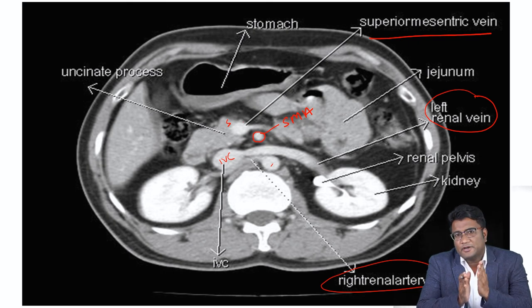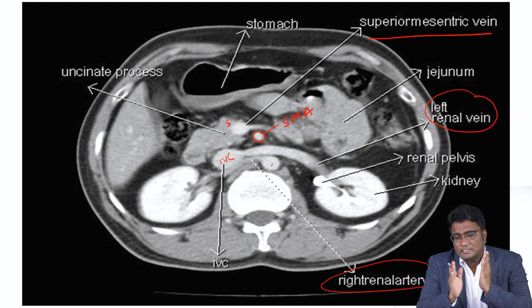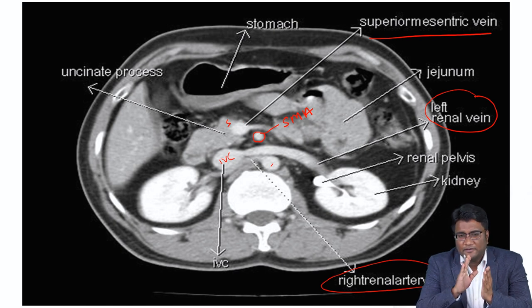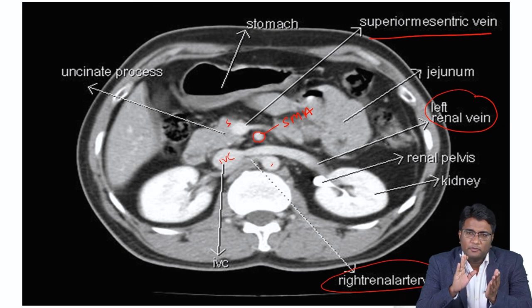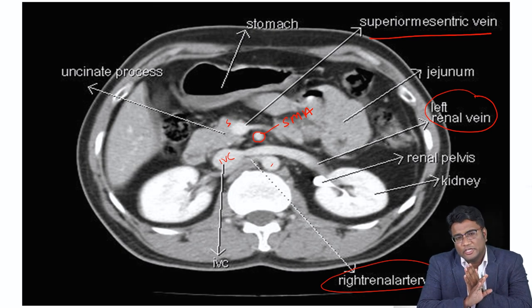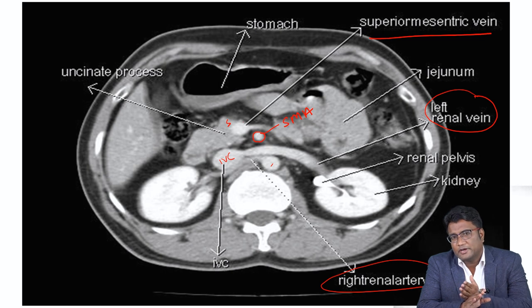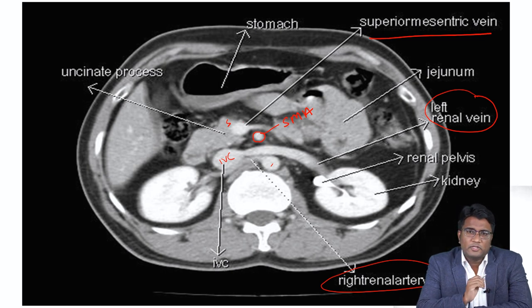The superior mesenteric artery normally lies to the left of the superior mesenteric vein. If there is a malrotation of the gut — if there is midgut volvulus or malrotation — you may have these vessels changing their position. The superior mesenteric artery may come to the right and the superior mesenteric vein may go to the left in cases of malrotation.